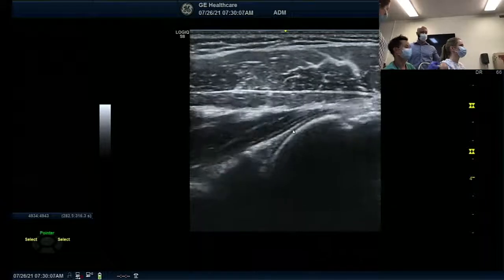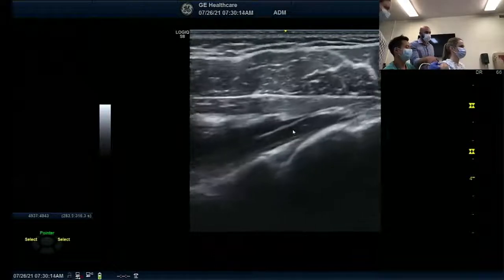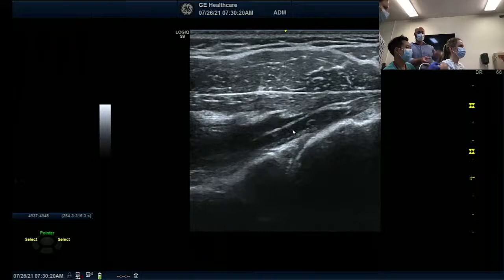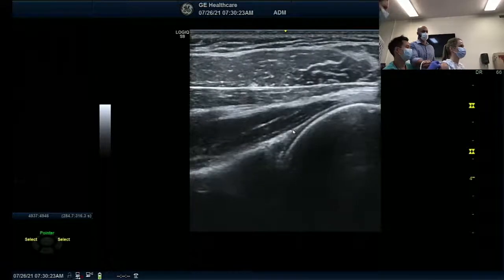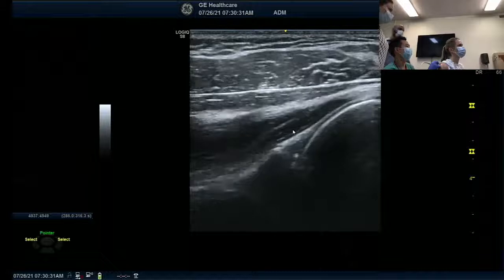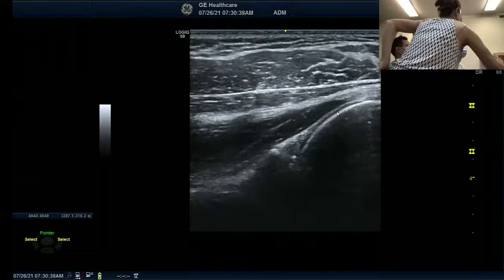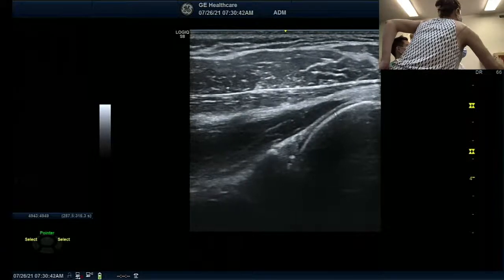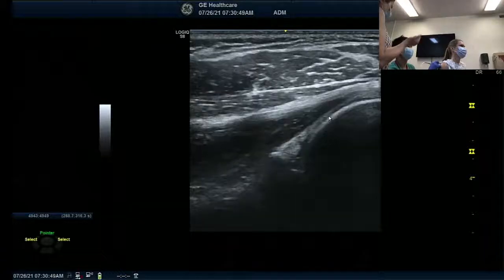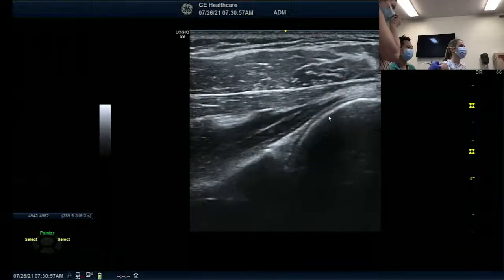You can go down and pull back a touch, and you'll see the dilation. You can come this way — medial — and keep your probe where it's at and come directly down. In Malenga's injection book, they show you coming from this way, but that's really tough because you have to hug the humeral head. Otherwise you'll shoot too far and you'll be in the infraspinatus muscle. Once you poke through the capsule and start injecting, if you see it's dilating and the space is getting bigger, then you know you're inside.